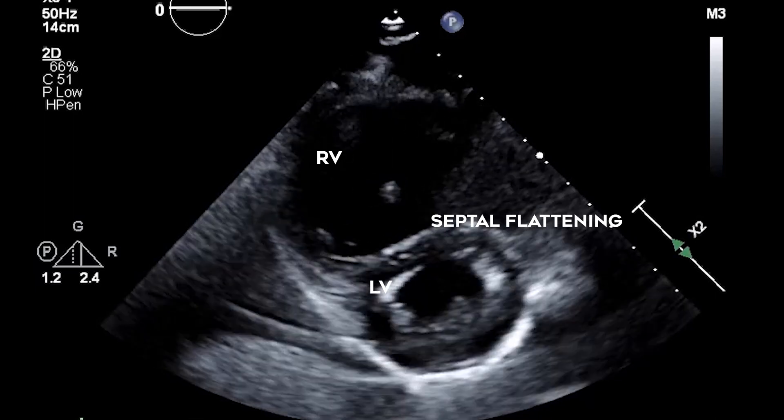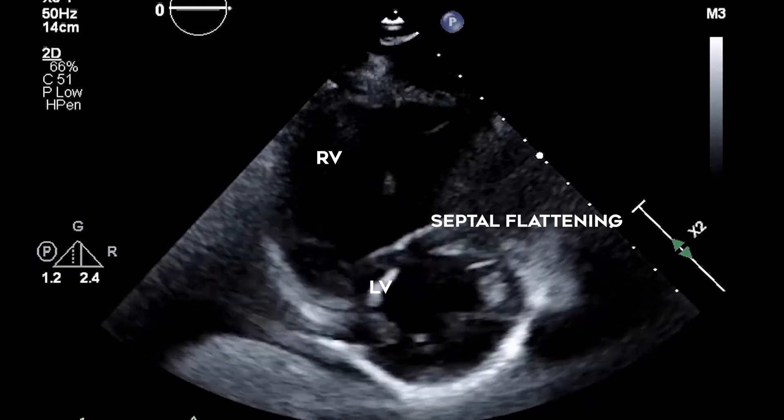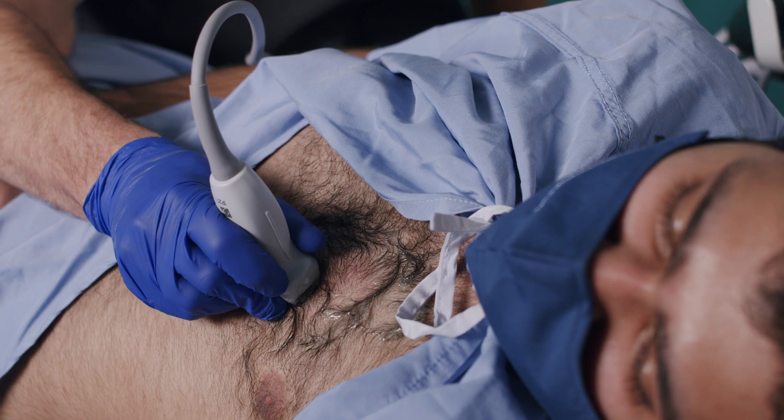If the right ventricle is significantly larger than the left ventricle in this view, consider right ventricular enlargement. Remember that because of the complex three-dimensional shape of the right ventricle, right ventricular enlargement should be identified in multiple views. In fact, this applies to all aspects of cardiac ultrasound — the more views in which you can visualize the abnormality, the greater your confidence in the accuracy of the diagnosis.